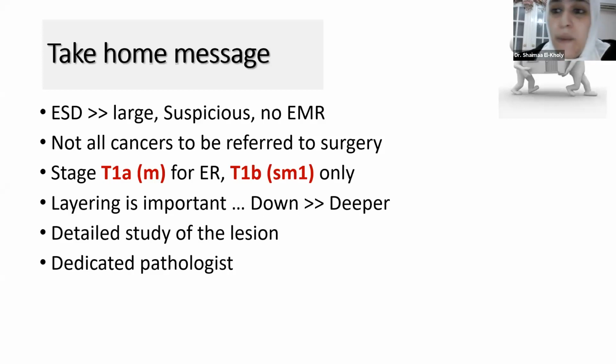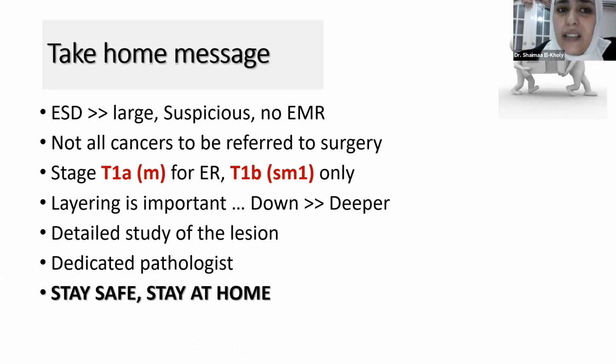You have to remember that our limit is T1A. T1B is an extended criteria, or it's controversial. You have to check your lesion in detail, and you have to know the layer, very important. And remember, as you go down, you can resect more deeply. And at the end, you have to have a dedicated pathologist for the ESD, and you have to communicate with him. And finally, stay safe, stay at home.